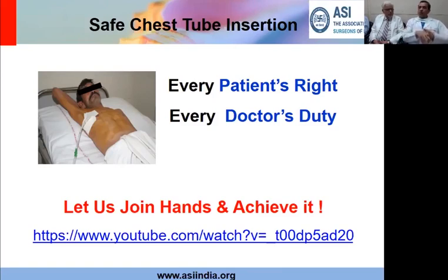Now, at this stage, I have seen people reaspirating, and we've had patients having had 7, 8, 9, 10 times aspiration. Remember, every aspiration in a radiology suite or wherever has a possibility of introducing infection. The more the number of aspirations, the more the chance of infection. So therefore, if any patient has been aspirated once and has reaccumulated and is again having fluid, I would go for a chest tube insertion, complete drainage, and keep the tube there for a few days. One-time, single, careful chest tube insertion, done properly, is safer than the risks associated with multiple aspirations being done. I hope I've answered.